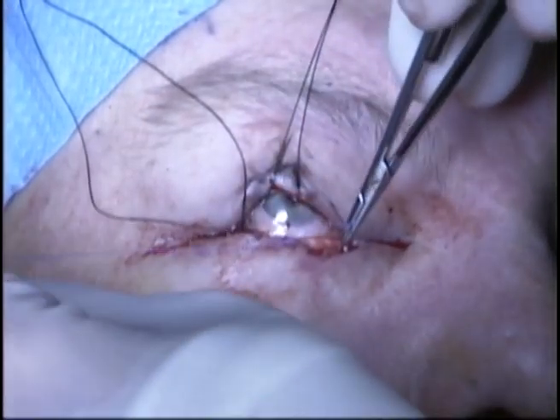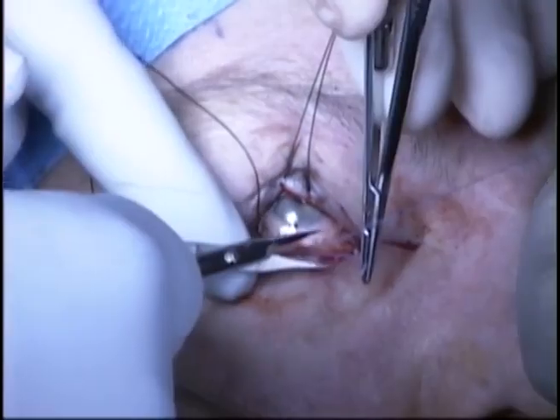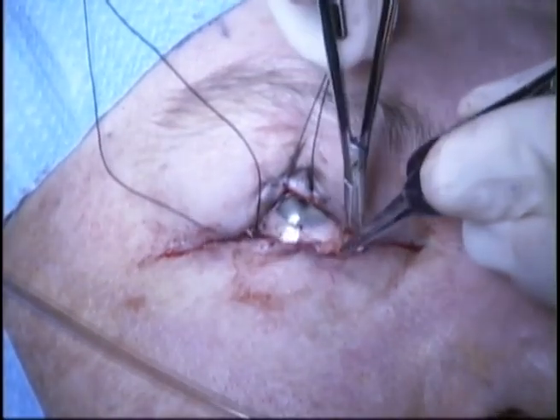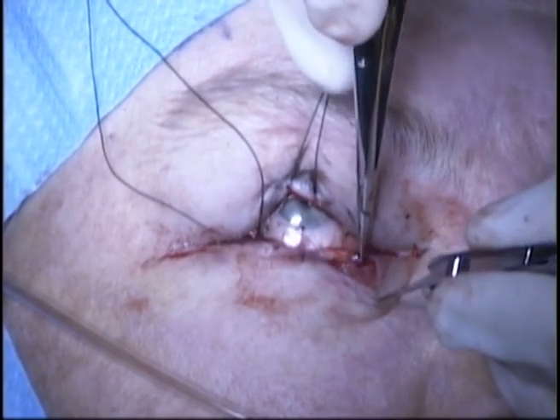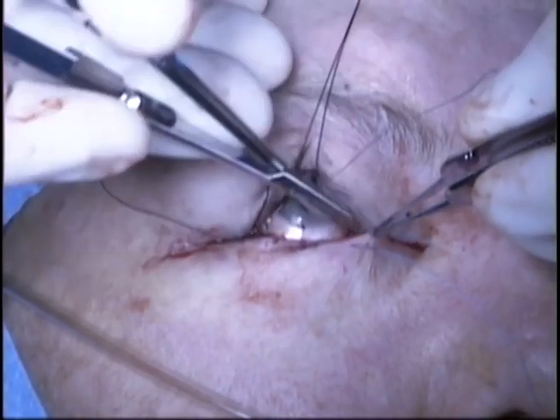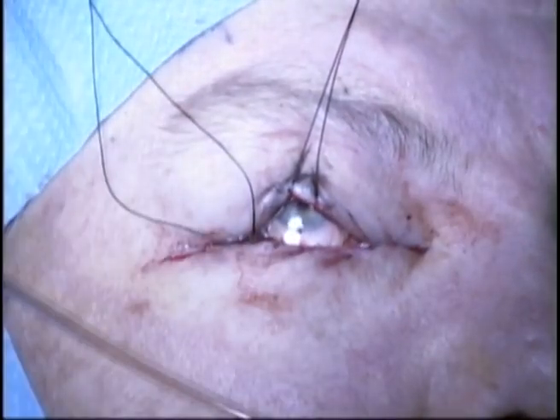This is essentially a mattress suture. An additional suture is placed medially. Tying the sutures adheres the myocutaneous advancement flap to the free tarsal graft. These sutures can be tied over bolsters if preferred.